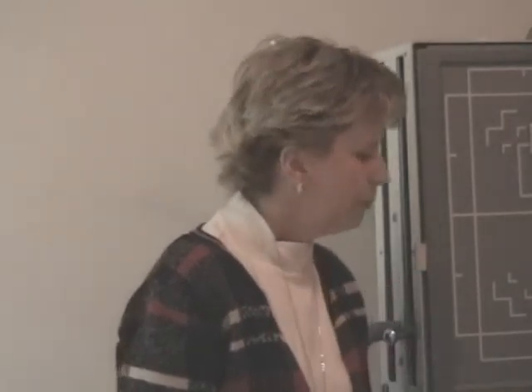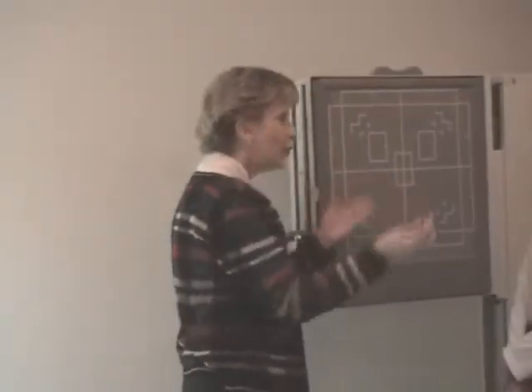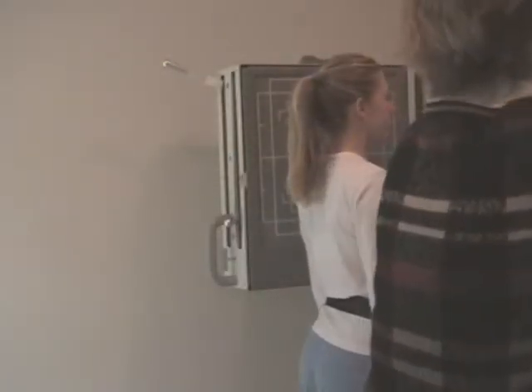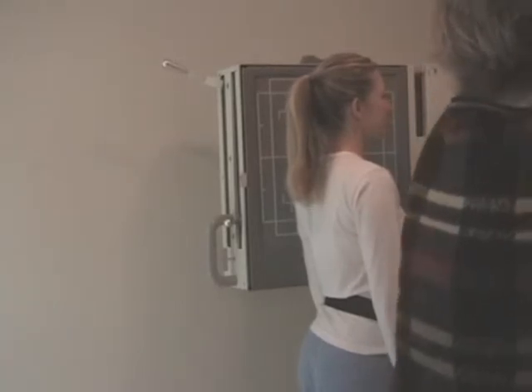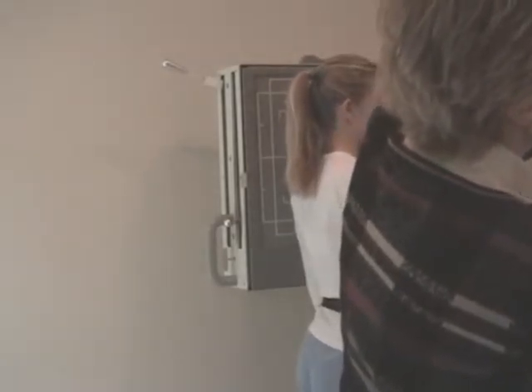Okay, so we're going to go back into we took the lateral, a normal lateral. We took a normal lateral, and now we need to do our obliques. The oblique has a 15-degree caudal tube angle.